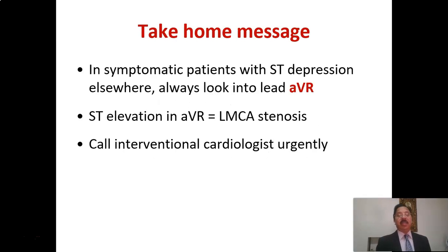So take home message: in a symptomatic patient with ST segment depression elsewhere, look at the aVR. ST segment elevation in aVR is equal to left main coronary artery stenosis, and call the interventional cardiologist urgently. And thank you very much.